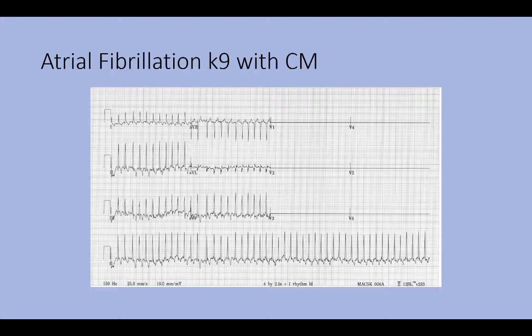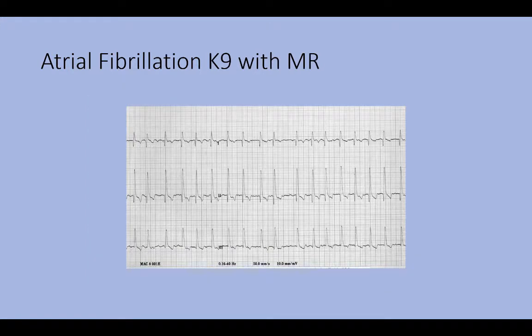Here is an ECG of a dog with atrial fibrillation. The bottom lead 2 rhythm strip shows upright narrow QRS complexes with a very rapid, irregularly irregular rhythm. Another ECG example in a dog with atrial fib shows a somewhat slower rhythm in lead 2, no obvious P waves, upright narrow QRS complexes, and in some leads possible F waves — oscillation waves — though no clear P waves are visible.